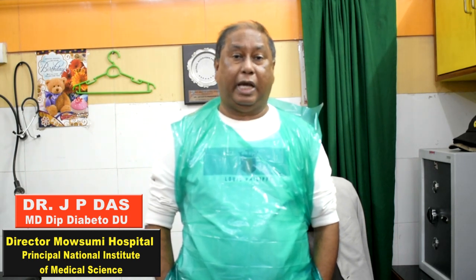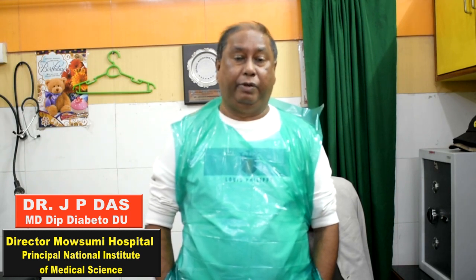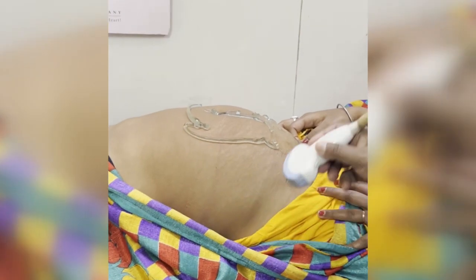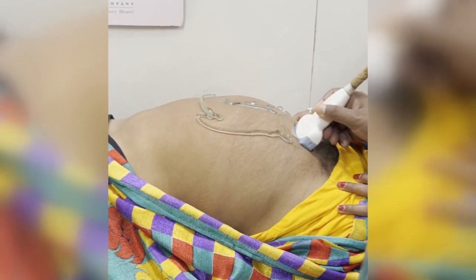Today we shall see a sonography scan of a small baby. How to do a scan of a small baby of 23 weeks, how it looks like, how to do it, we shall learn from today's video. Sonography of a small baby. And I am putting my probe over the lower abdomen.